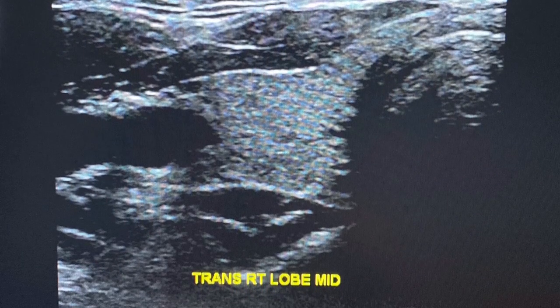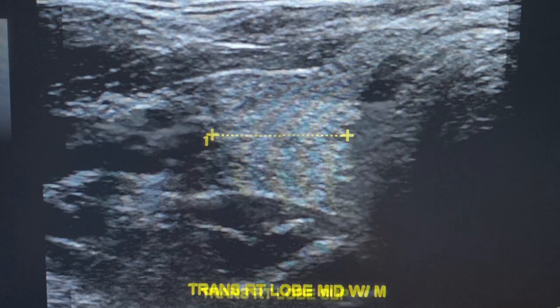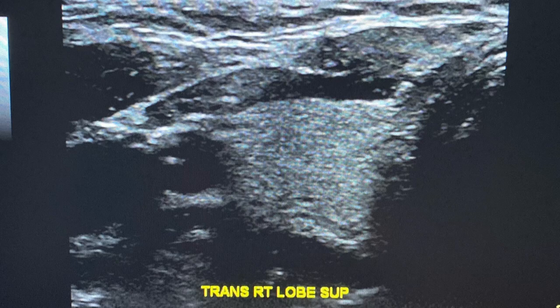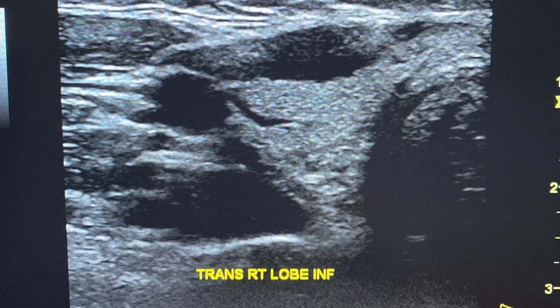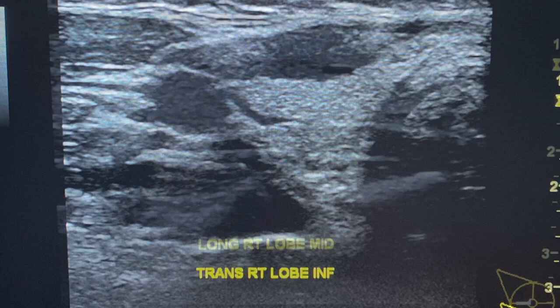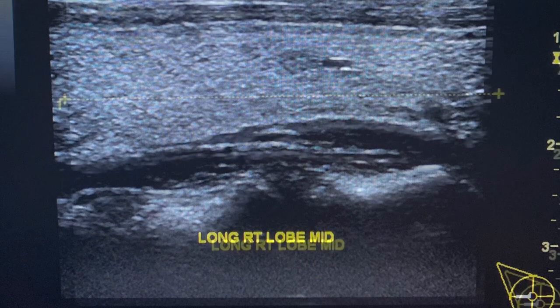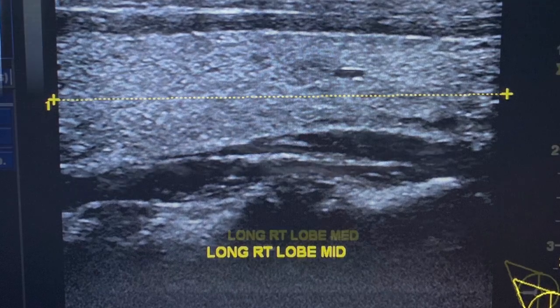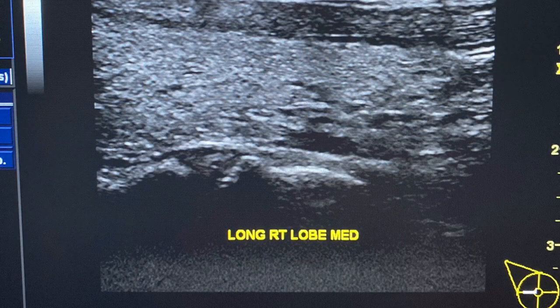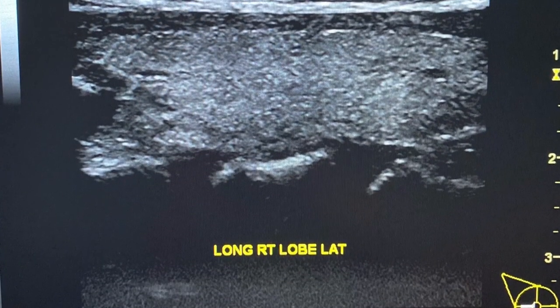Then go on to the right lobe, measure the right lobe in trans, and then go superior to inferior as well. Moving from trans to long, you'll be taking a picture in mid-long, and then taking measurements for mid only. From there, you'll be going from medial to lateral, which will complete your last images of the right side lobe.